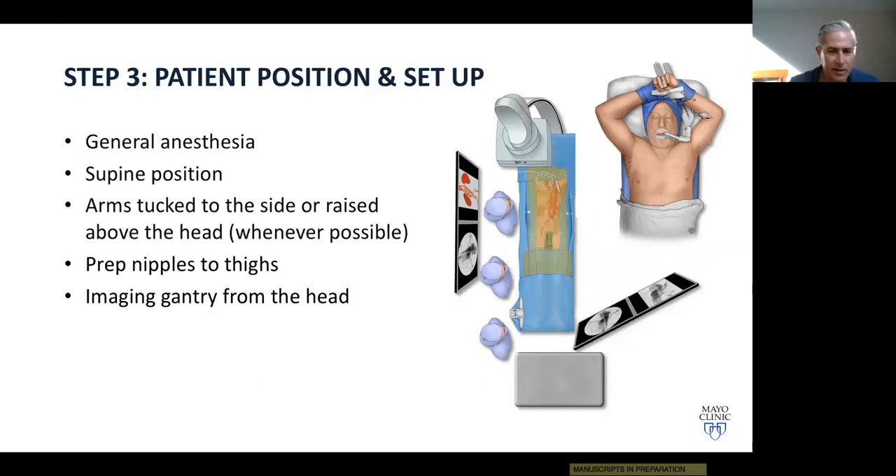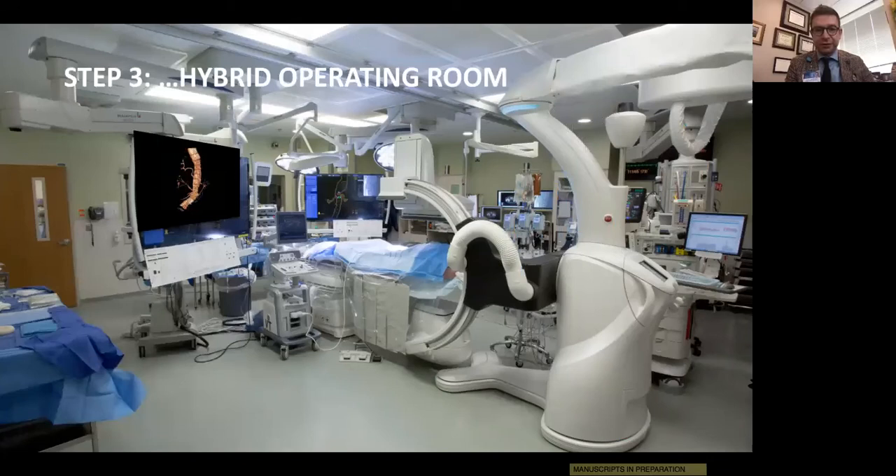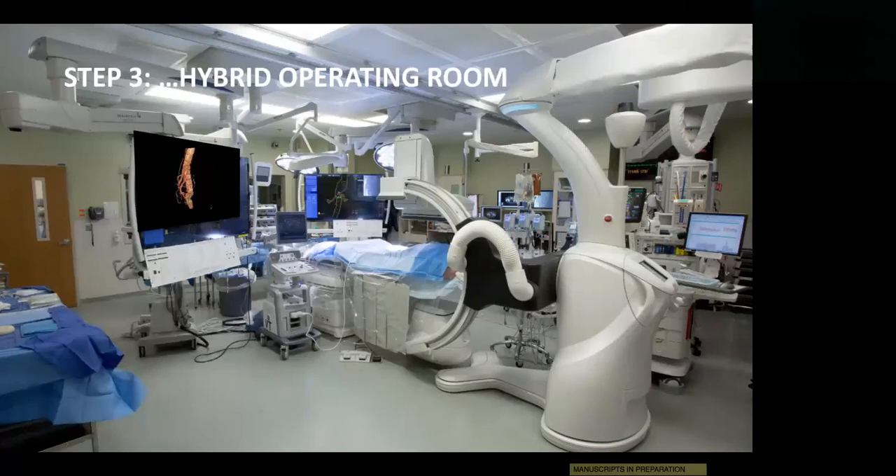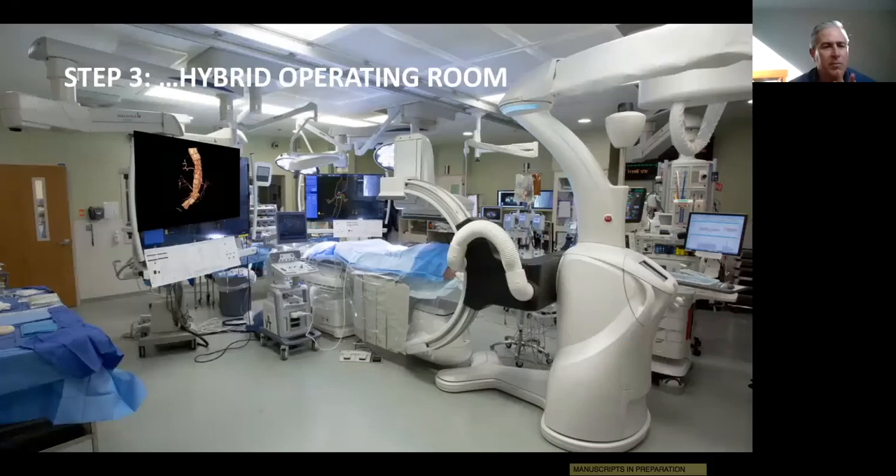Regarding room organization: having plans handy and taped alongside the screen provides easy access for the whole team and nurses. The room layout allows getting down to the pelvis with the gantry at the head easily. Historically, the C-arm came in from the left side of the patient for aortic cases, but bringing it from the head — a technique picked up from the Cleveland group — allows consistently visualizing the head of the femur. This unit has a 40-centimeter imaging detector versus 30 centimeters on most others, so this position rarely causes imaging issues.